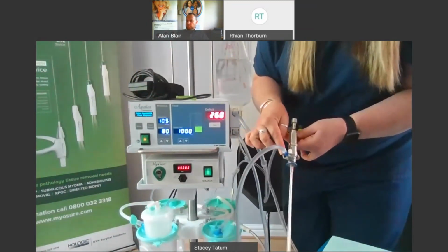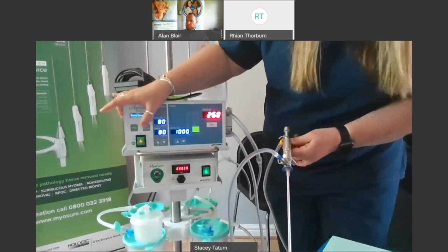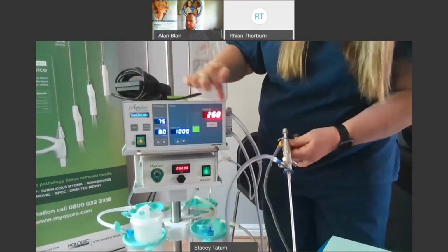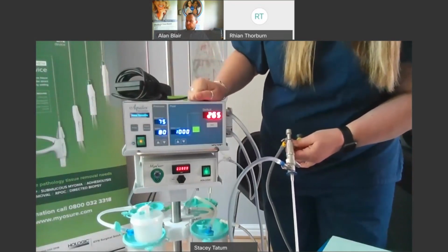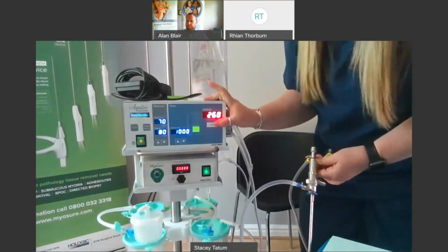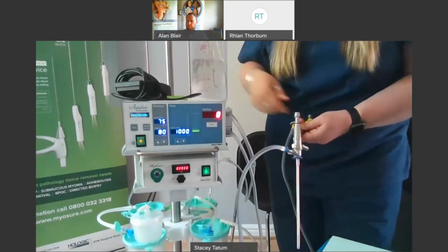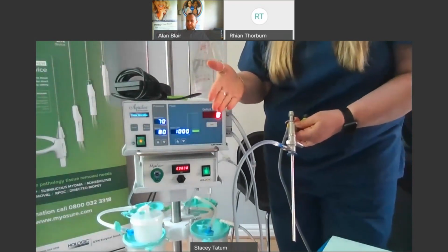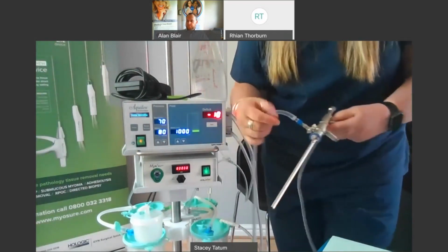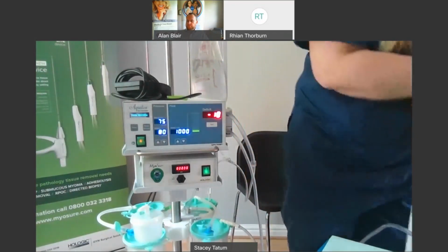So you ask the surgeon to close the blue stopcock. They may, in turn, ask you to pause the machine instead. Now, as Alan said earlier, this fluid has been nowhere near our patient, so we don't want it in the final tally. So we press and hold until it goes to 0, and then the surgeon can go in and have a look and see what pathology is there. Once they've done that, they will then ask you for the blade that they would like.